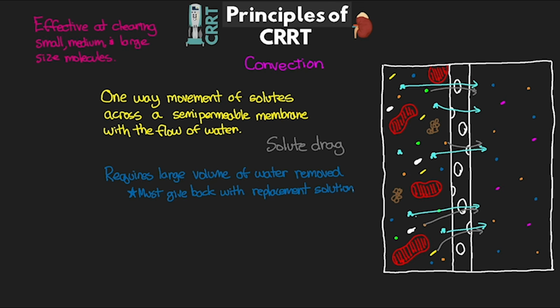I'm going to explain that more in just a minute, but eventually it was explained properly to me that by adding this fluid, it allowed us to pull more fluid via the hemofiltration, and this resulted in additional convection and ultimately more solute clearance. But at first it seemed quite backwards: by giving them this solution as it was going to the patient, how was this impacting any sort of clearance of solutes?